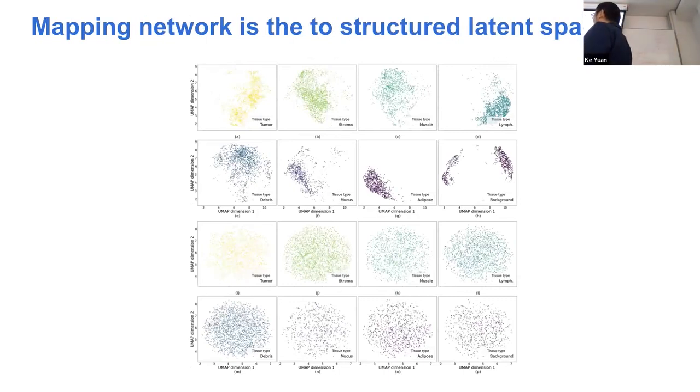So we take a look at what the effects of those setups in the GAN are that gave rise to this, because when we set it up, we didn't expect to see this. We did nothing artificially to impose this in the latent space. So what we did is essentially take out various components of the model to see what's happening. It turns out the style transformation is the key.